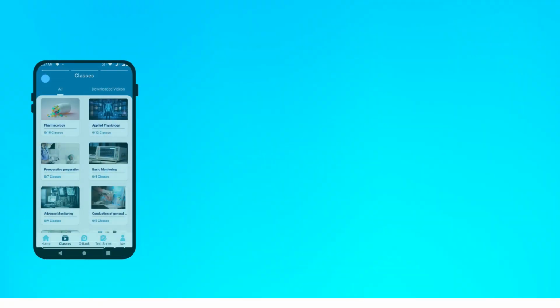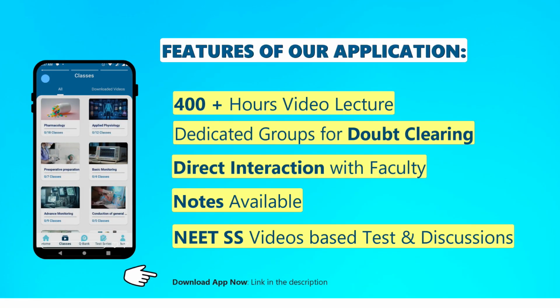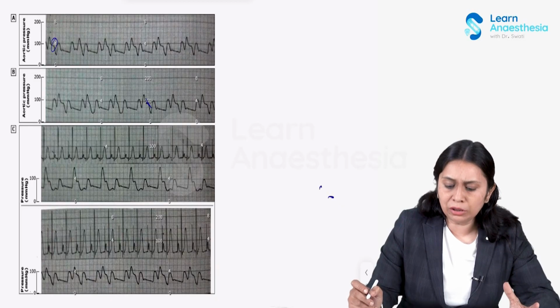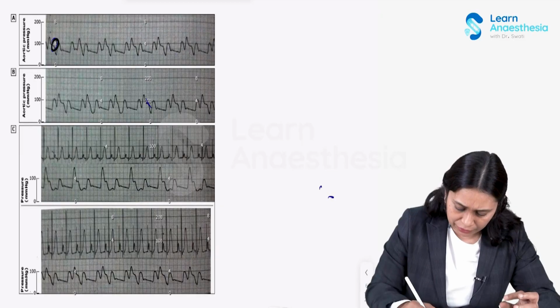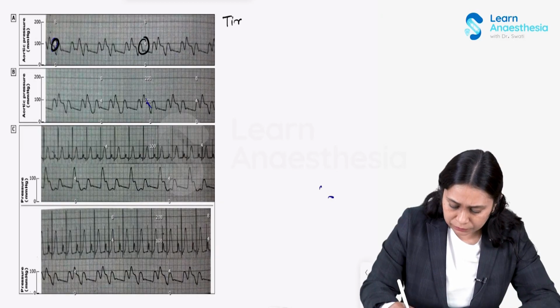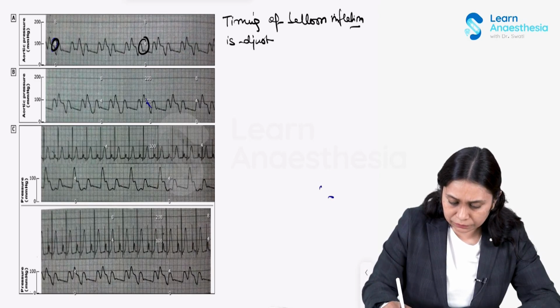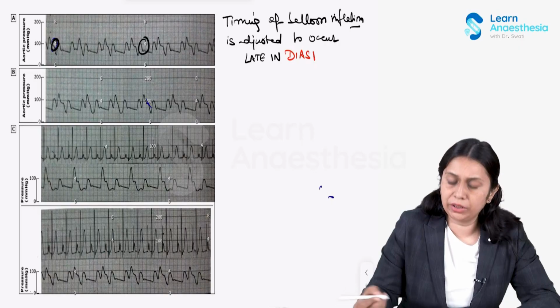So remember, the timing of balloon inflation is adjusted until it occurs late in diastole, just uncovering the dicrotic notch.